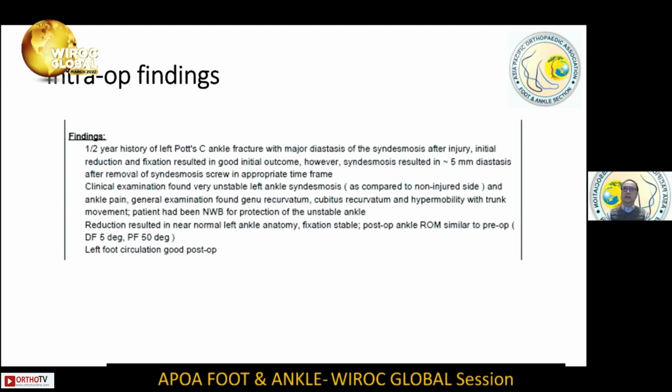This is an intraoperative finding which confirmed the residual diastasis of the distal tibiofibular syndesmosis. It was actually totally unstable. We could put an arthroscopic probe into the distal tibiofibular syndesmosis while performing the arthroscopic surgery. After fixation, the ankle was stable, and the range of motion was similar to the pre-op condition, with a dorsiflexion of 5 degrees and 50 degrees plantar flexion.